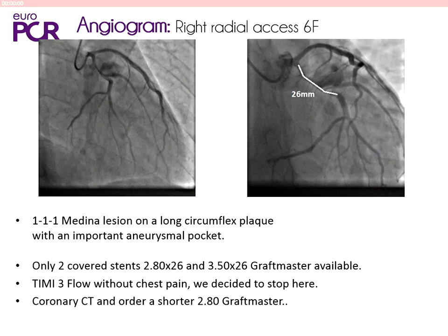Honestly, we are working in a center where the surgery is 10 meters from the cath lab. We called the surgeon at the first coronary angiogram. He said, okay, it's an easy job for you, you can do it. And when we came back with acute coronary syndrome, we didn't ask questions, you have to go, you have to open arteries. But in the beginning, we asked the surgeon to see the pictures.